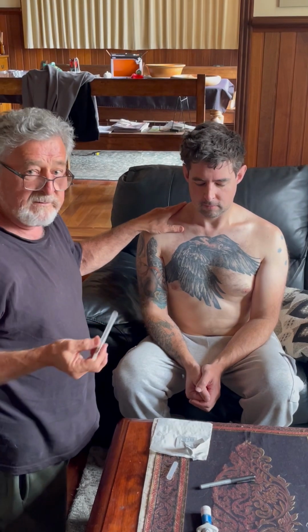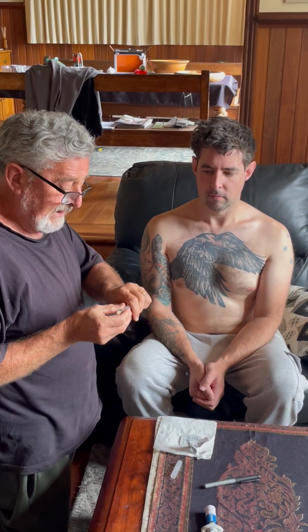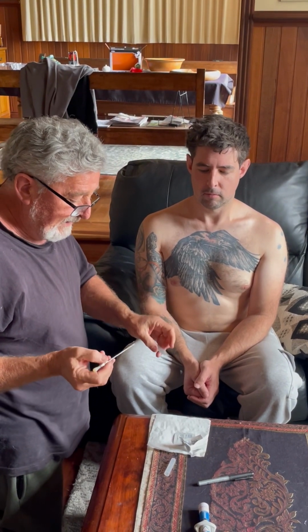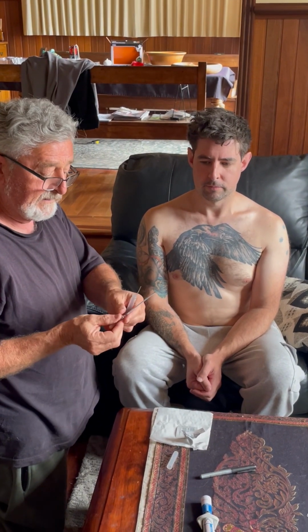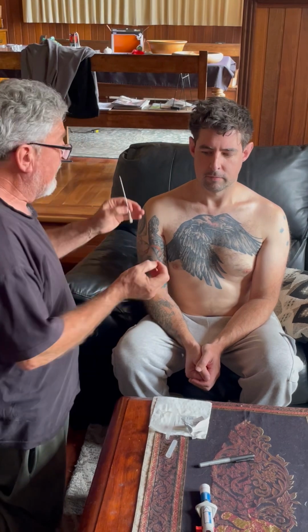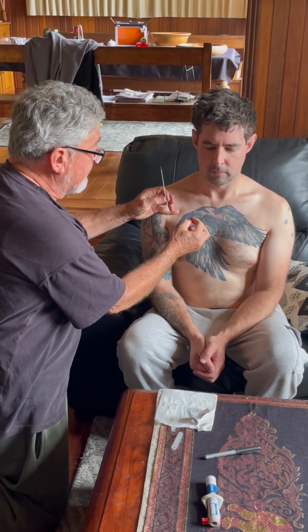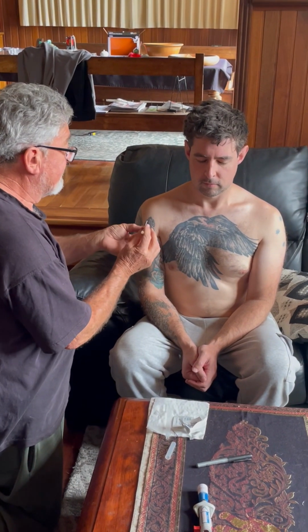What we normally use is a 14 gauge Jelco, or there are various other cannulas available for chest decompression. They're generally about 14 gauge. The main thing that a lot of these have is the needle's longer. In this particular case, we have a needle in a sheath that's essentially a large cannula. This also comes with a little knife. If we wish, we can do a subcutaneous cut around that area, but in most cases it's not necessary.